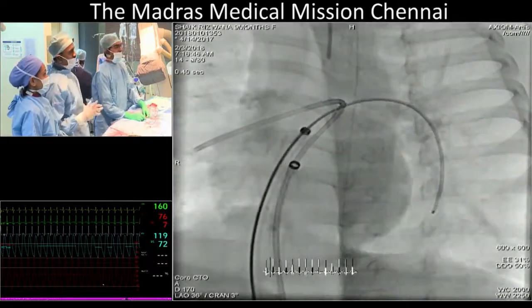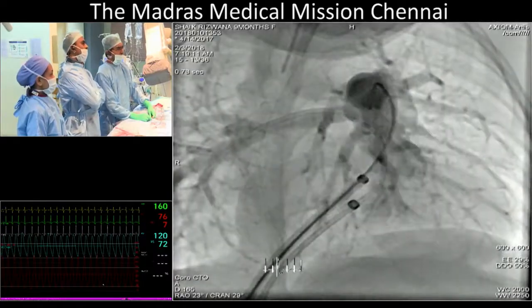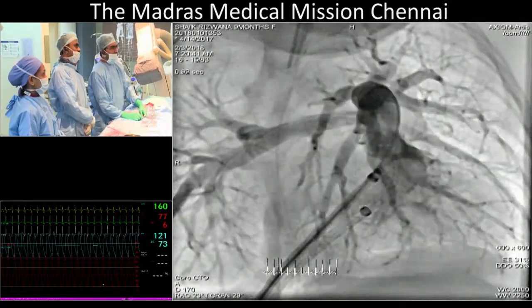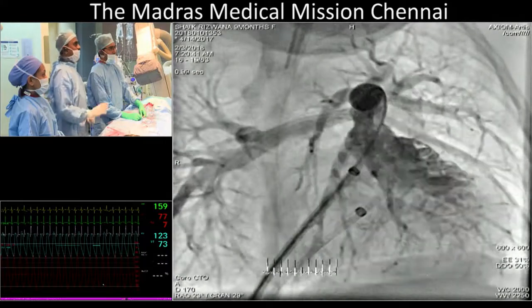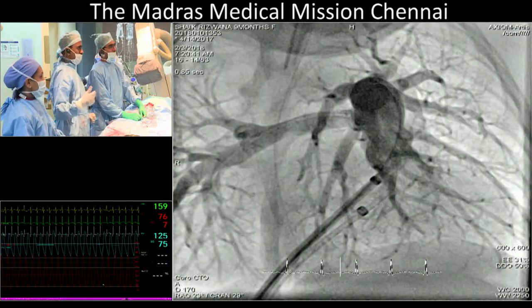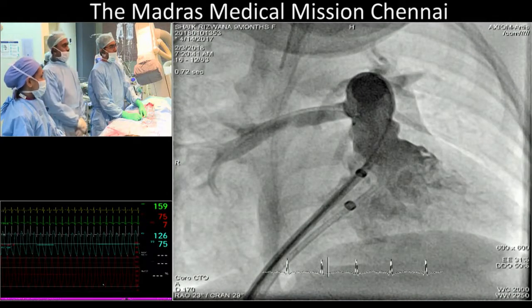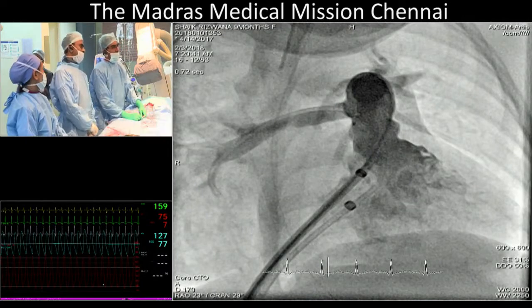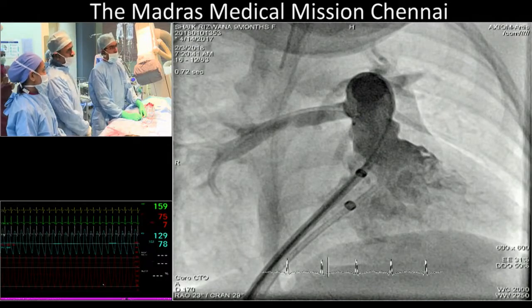Okay, and then next picture. I think next was better. Freeze it. Previous. Yeah, freeze it. The flap is less impressive. It's still there. But even though we have a lumen that is wide open, the gradient was 70 millimeters across this area from the hilum to the right pulmonary artery.